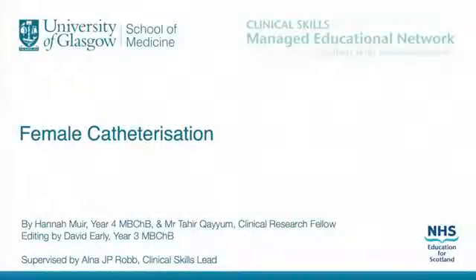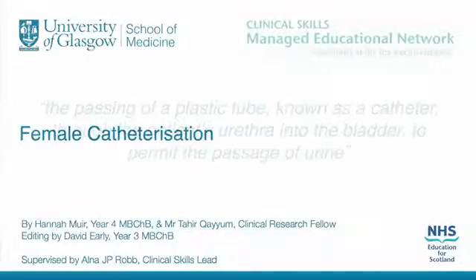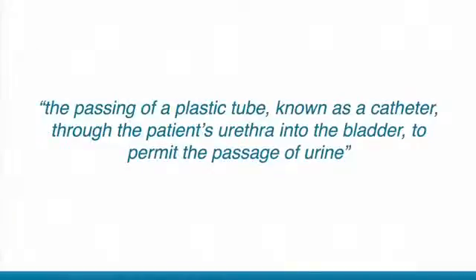Welcome to the Clinical Skills Podcast for Female Catheterisation. This podcast will cover the procedure for the insertion of a female urinary catheter using a Foley catheter only. Urinary catheterisation is the passing of a plastic tube known as a catheter through the patient's urethra into the bladder to permit the passage of urine.